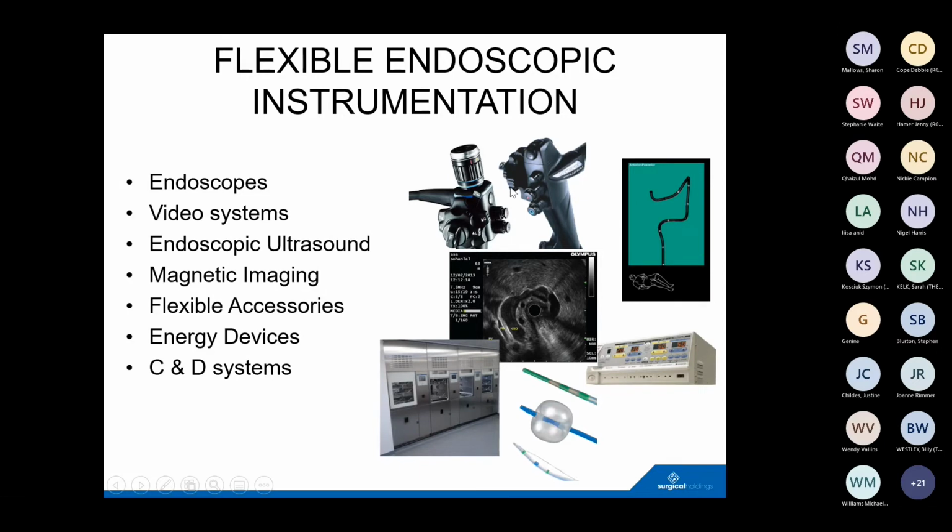So, that's a fiber optic instrument with an eyepiece. This is a video instrument without an eyepiece, but you can see some buttons on the top, which I'll come back to in a minute. Because that has a chip at the tip of the instrument, you need to get the image back and then display it on a screen. So there's video systems, you need video processors, display systems, so high resolution screens are used.